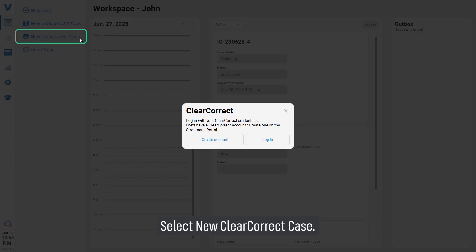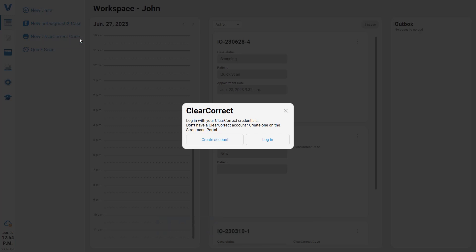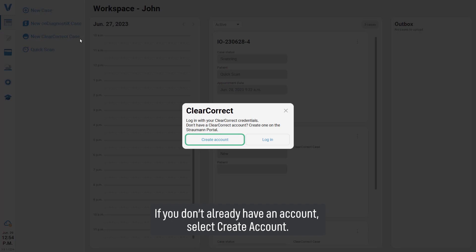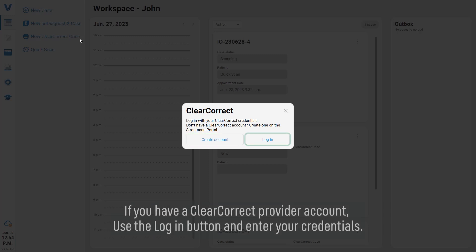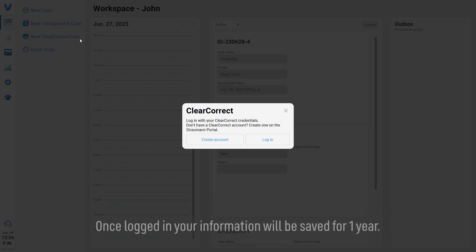Select New ClearCorrect Case. If you don't already have an account, select Create Account. If you have a ClearCorrect provider account, use the Login button and enter your credentials. Once logged in, your information will be saved for one year.